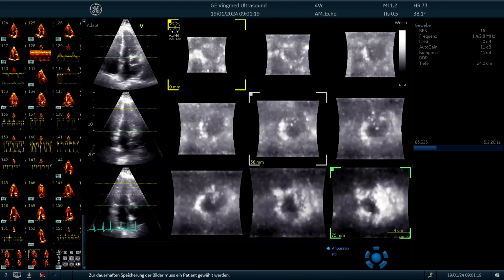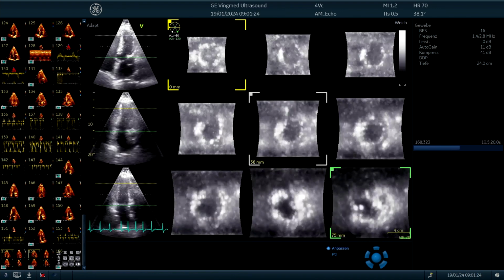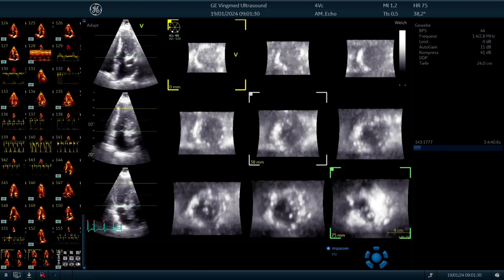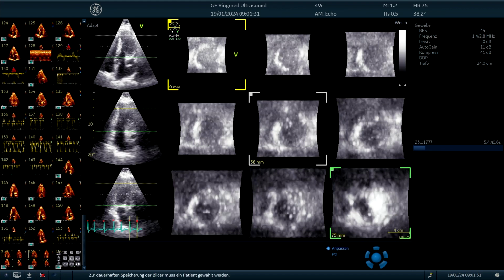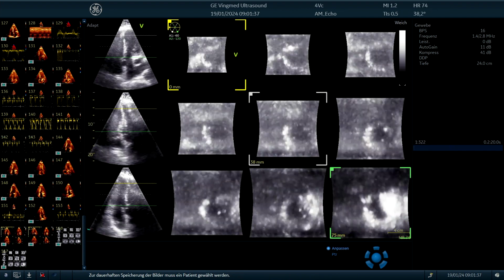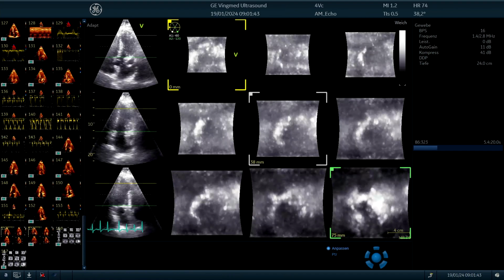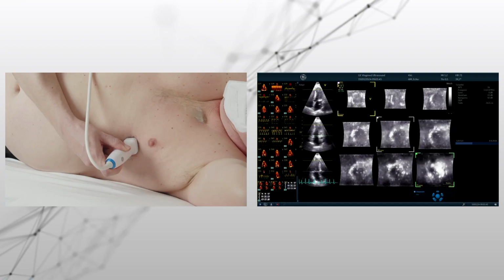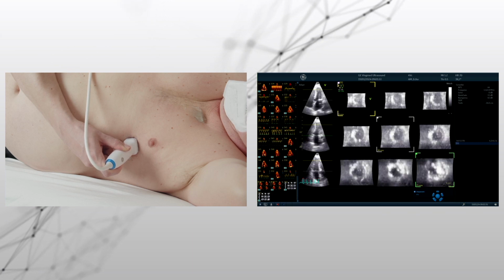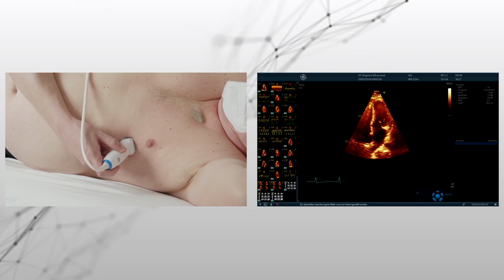Und bitte wieder einatmen. Stop. And as he inhaled, our image is a little bit better. Now we see it better, and then we use the multi-beat. Now it's calculating 6 beats, it's like in MRI, and then we can save it. Weiteratmen, perfect. And we tried again, normal weiteratmen, to have the optimal image first. Bisschen einatmen wieder. Stopp. Und so die Luft anhalten. Perfekt. And then multi-beat, of course the patient should be able to hold his or her breath. But here we have a nice image. Perfekt, weiteratmen. Now we have the 3D data set.